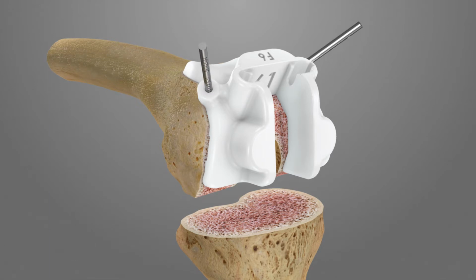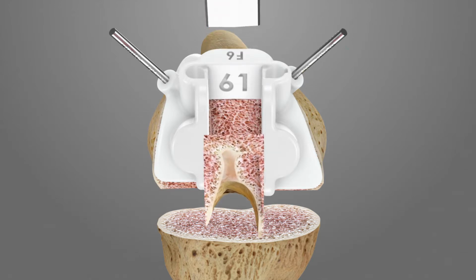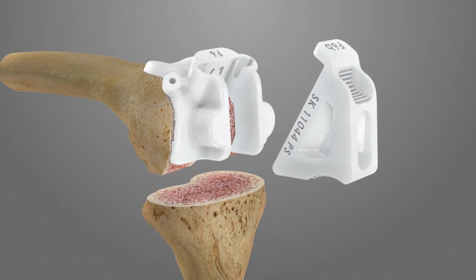Insert the drill card iJig F6A into the F6 iJig. Drill and insert Steinman pins into the pinholes within the F6A iJig. Remove the F6A iJig and the Steinman pins. Create the box resection by cutting vertically downward with the edge of the saw blade set flush against the iJig surface around the three sides of the F6 iJig. Remove the Steinman pins. Use the F6B, the box gauge, to check the accuracy of the box resection.